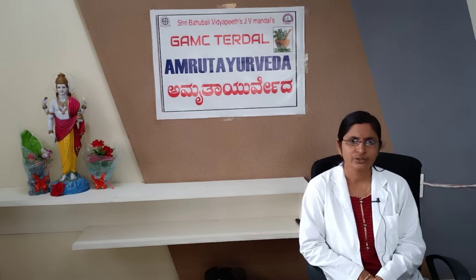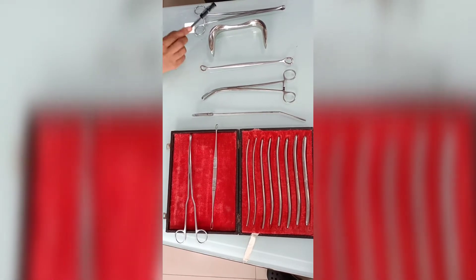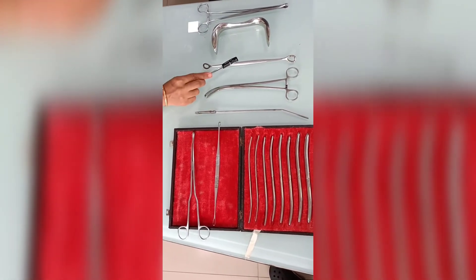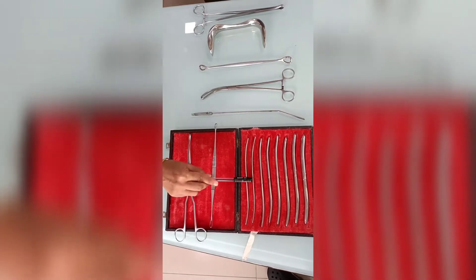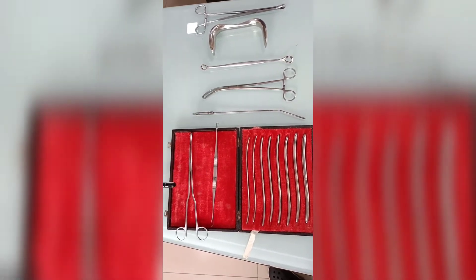Now we will see the instruments arranged in the chronological order of use: Sponge Holding Forceps, Sim's Speculum, Anterior Vaginal Wall Retractor, Valsellum, Uterine Sound, Hegar's Dilators, Uterine Curette, and Forceps.